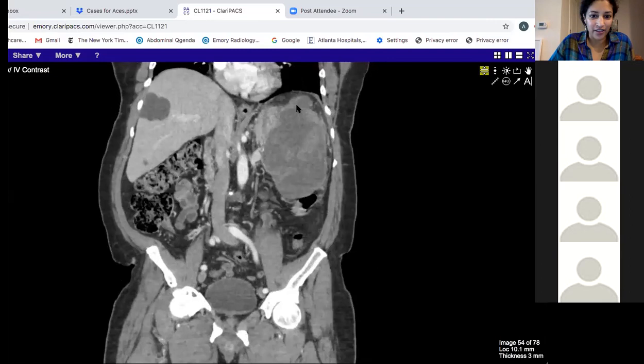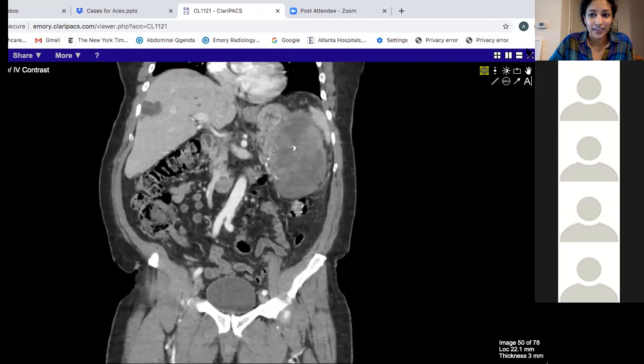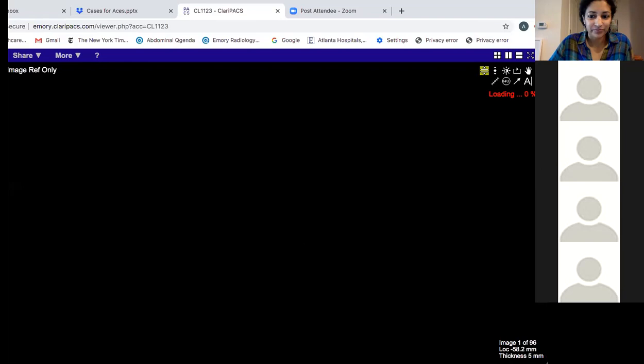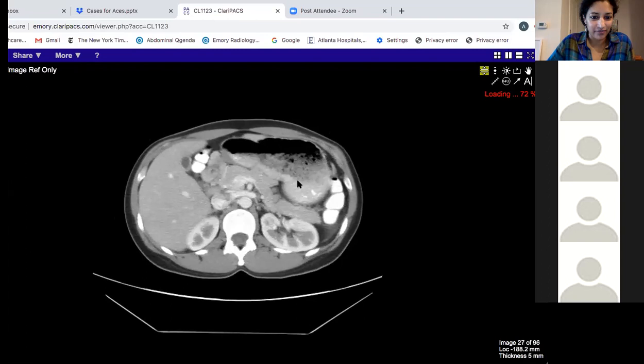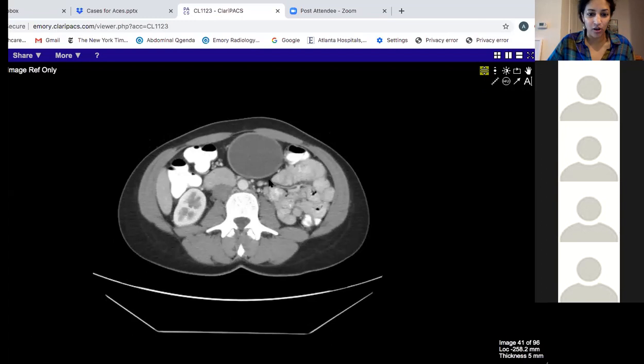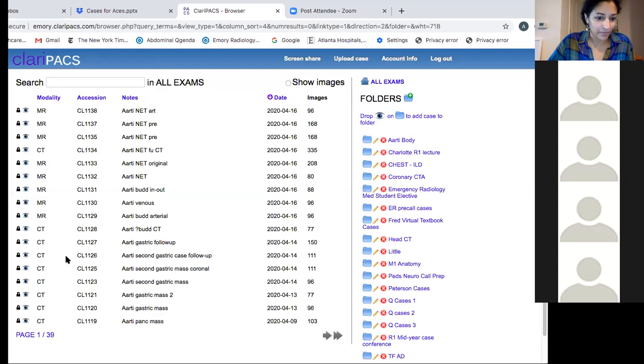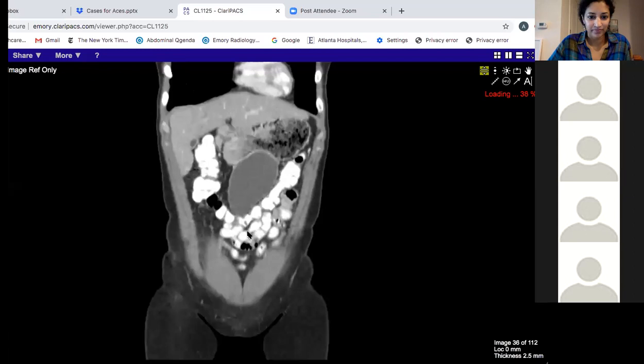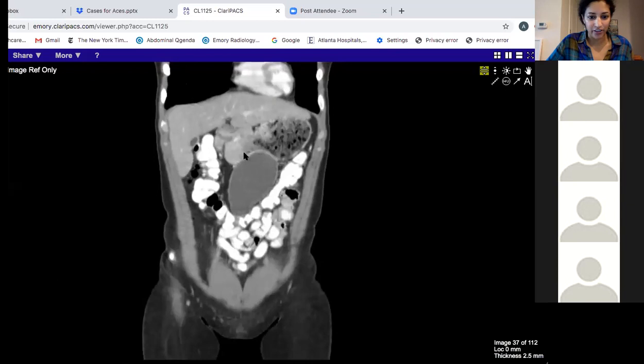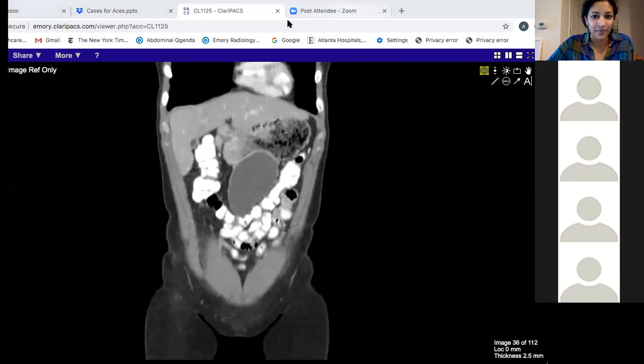A schwannoma was brought up. You can see it's pretty elongated, calcified, solid mass, and it has this interface here with the stomach. I have a companion case — this is a completely different patient and they have the same entity. Here is a cystic lesion with a mildly thickened wall; it doesn't look as complex as the last case. On the coronal it's oblong, mildly thickened wall, with a broad interface with the stomach. Githanjali and Alina are saying duplication cysts — and yes, these were both duplication cysts.